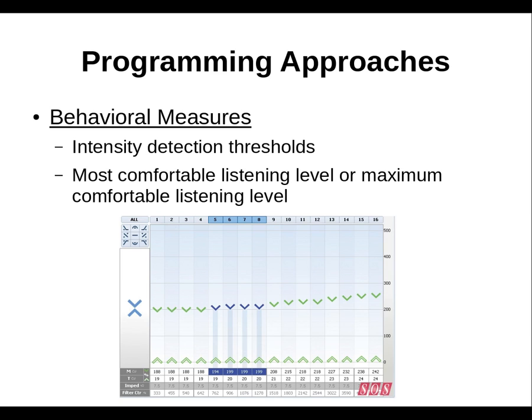And so for detection thresholds for adults, you may use just conventional audiometry. For children who are, say, 5 and older, conventional audiometry. But similar to pediatric testing in general, we'll have conditioned play audiometry and visual reinforcement audiometry for the age-appropriate populations. Now, one of the things that's going to differ between hearing aid users and cochlear implant users is the upper bound. I was mentioning the upper bound for a hearing aid user would be the loudness discomfort level.